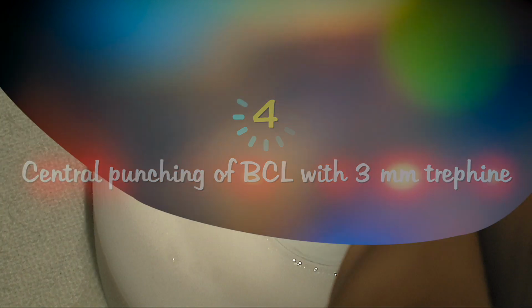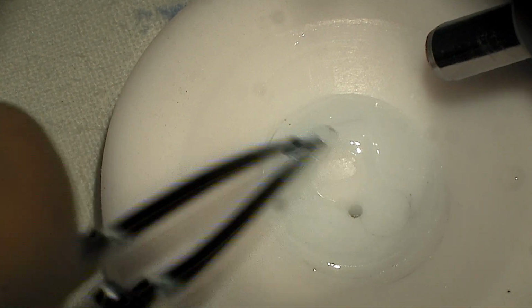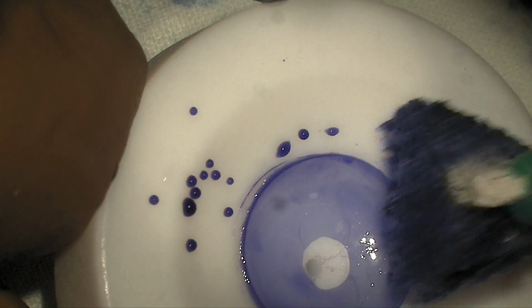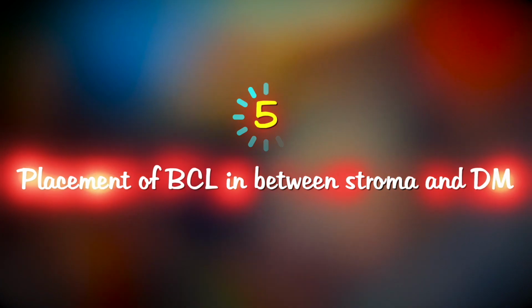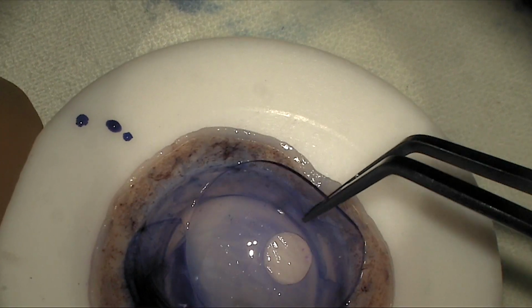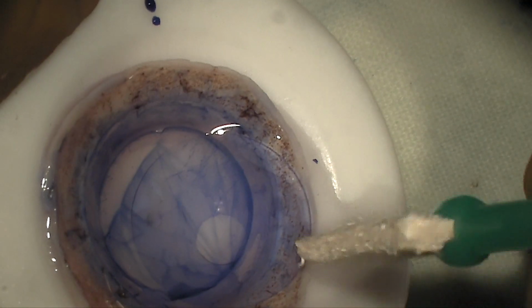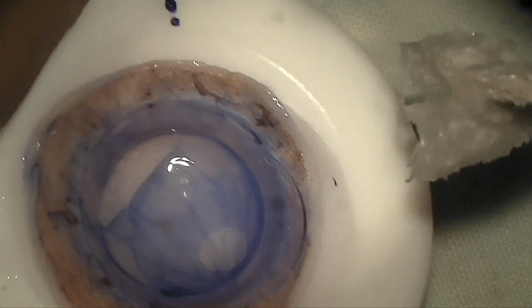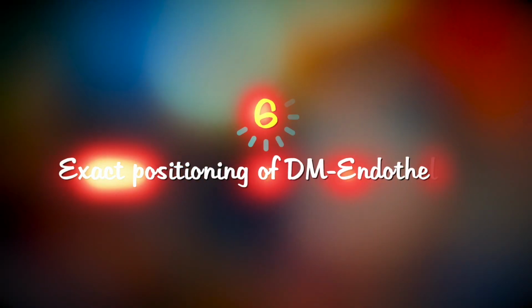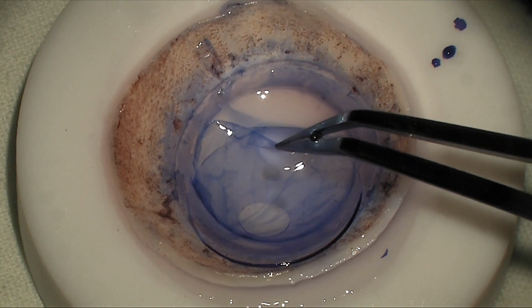Central punching of the BCL with a 3 mm trephine. Placement of this windowed BCL over the stroma and then careful flotation of the DM endothelium over it. Good centration of the DM endothelium over the BCL.